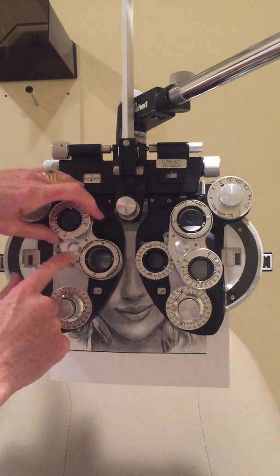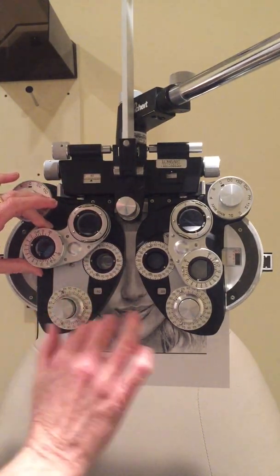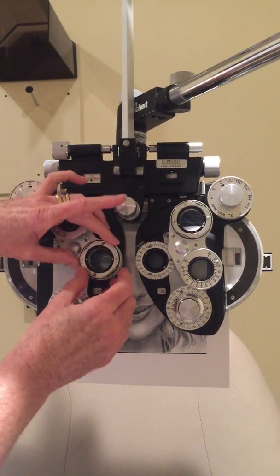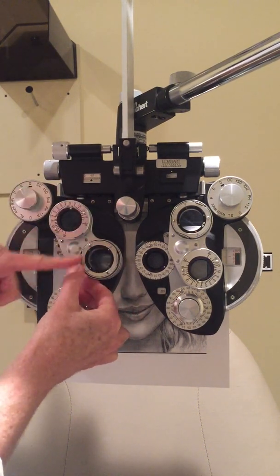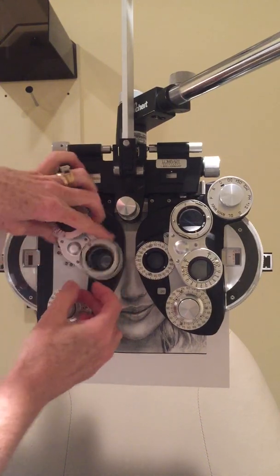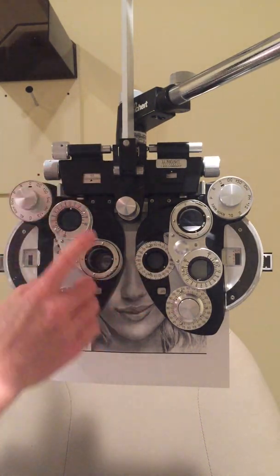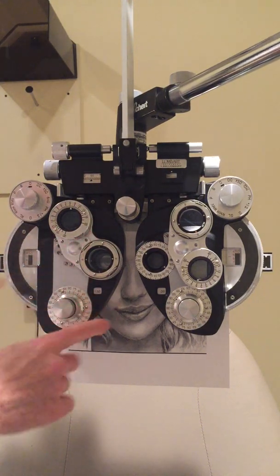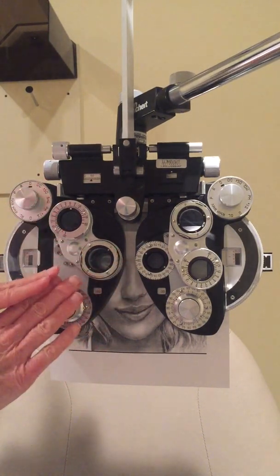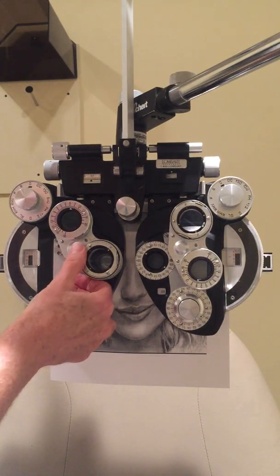I flip the JCC — Jackson Cross Cylinder — into place. The arrows show the phoropter cylinder axis is set at 180. When the JCC rotation aligns with the axis, I'm checking axis orientation. When the P for power is lined up with the axis, I'm checking power. She already has a diopter and a half cylinder correction in, so I start with axis refinement and ask: 'Do you like it better with one or two?'